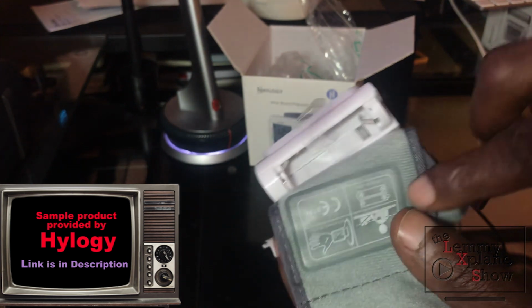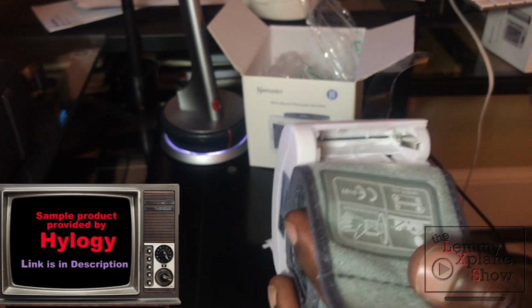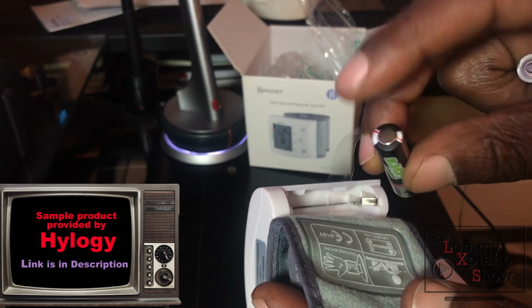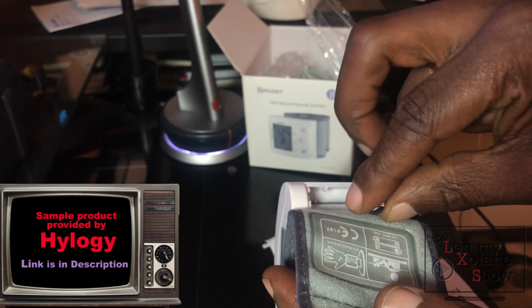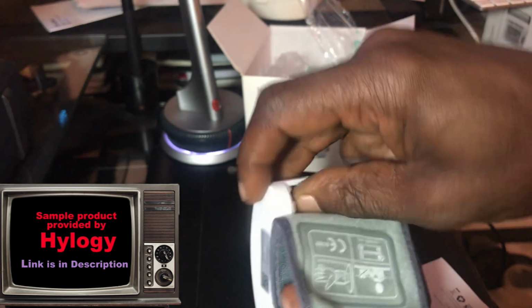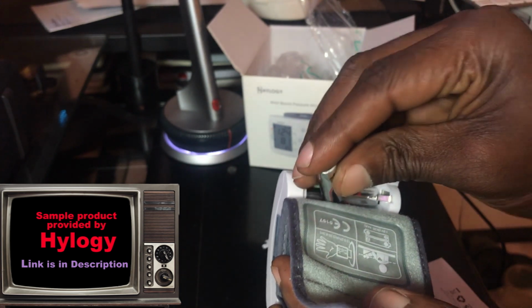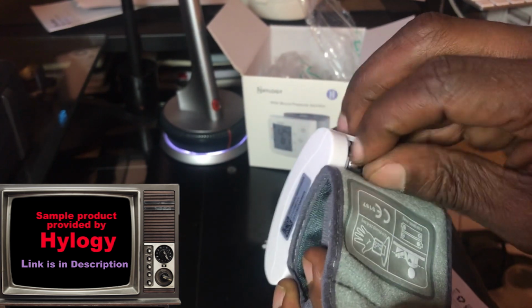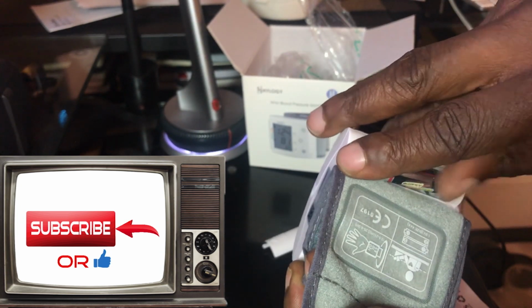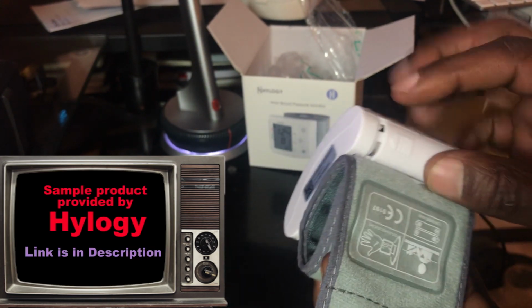So the instructions are right here on how the batteries go. I was going to do the batteries off screen, but I decided to do them on screen because it's a bit tricky putting the batteries in. So what I've discovered is if you load it first like that, almost straight in, and then you lean it down, so that's the first battery that goes to the bottom, then you push it in, make sure the plastic is under it, and then the second battery goes on top. That's the easier one to put in. Oopsie. Not as easy as I thought it would be, but we'll get there. There we go. So our batteries are in. We'll put over our cap.